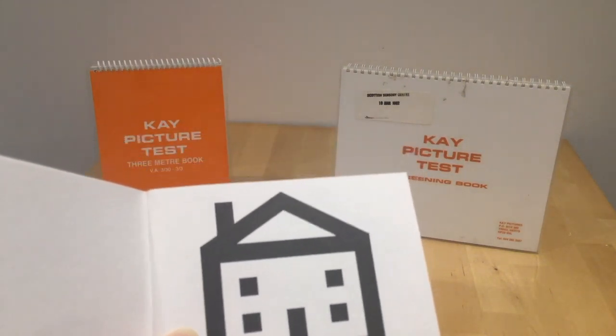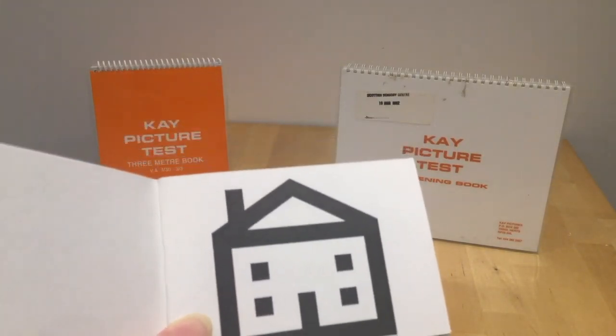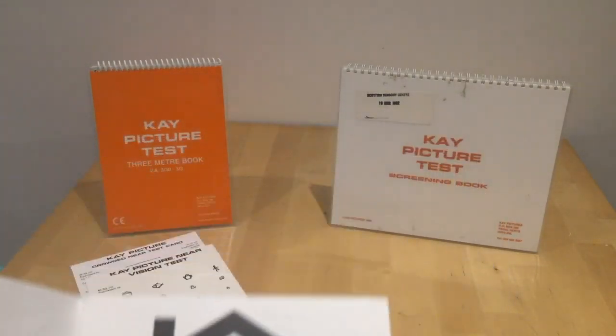So you have to be aware of that when you are doing the test itself. This is just the screening part that you do at the beginning to make sure that the test is suitable for that young child or person.